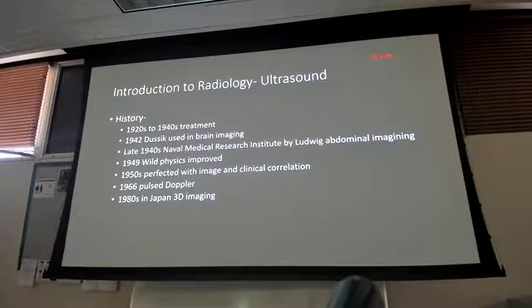When did it start? It started in the 20s and the 40s. Really, ultimately, it was the Navy that we got this from. Any Navy in here? No, it's like the one good thing the Navy gave us. I say this with Navy in there as well. They've been dealing with ultrasound for years before we used it for medical imaging. Doing what? Radar, sonography in the water, right? That's what they were doing.